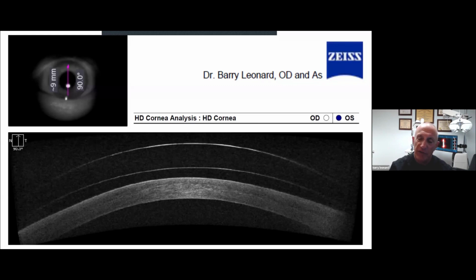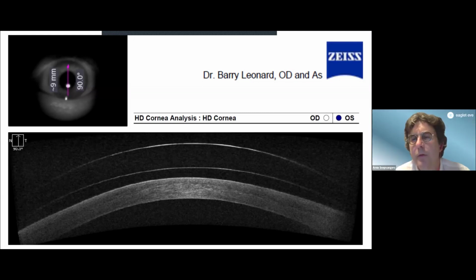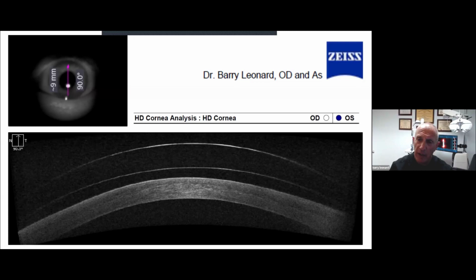So this process just took a couple lenses and we were there. Right. And that's adding, I don't put the front toric in right away. I don't do any of that, but that's adding the front toric. We could do that immediately. So that's a very good point, Arnie.